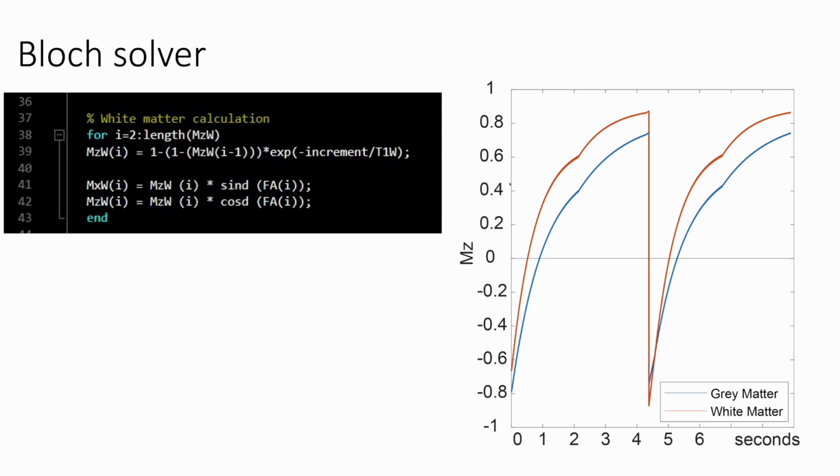So here you see the same thing from the MZ magnetization for the sequence that we just looked at, where we have inversion relaxation, but you see we have kind of two partitions. So those are the two TRs, because Kenny was worried that just having one TR, we are not in steady state yet, so he simulates several of those to go into a steady state. To also account for the magnetization loss from the previous TRs.